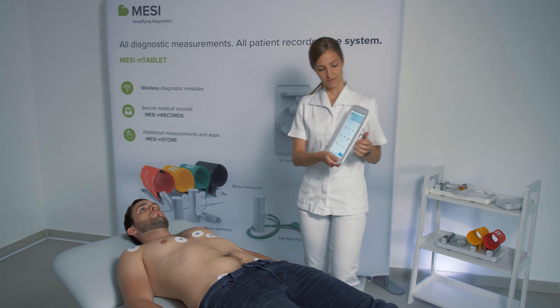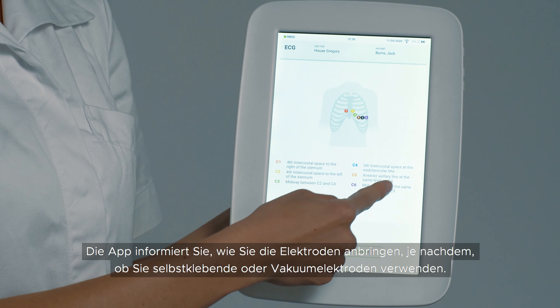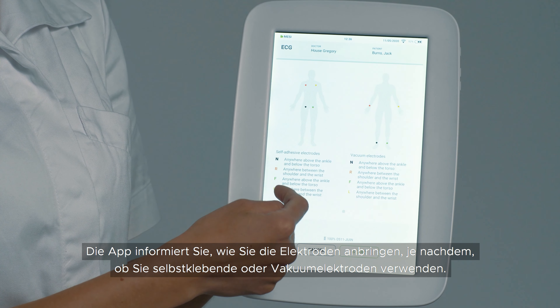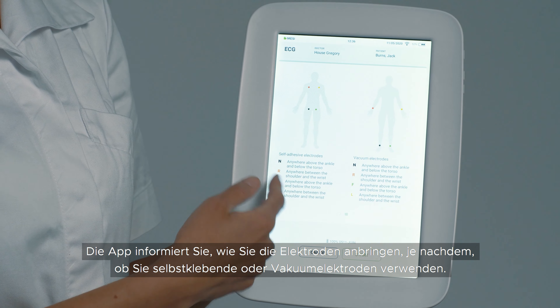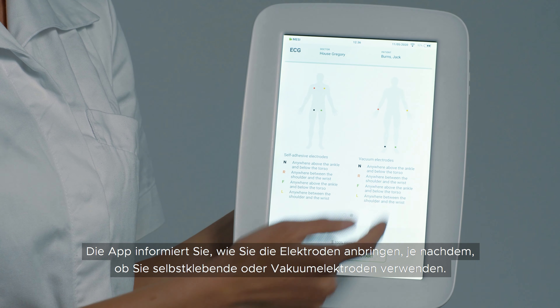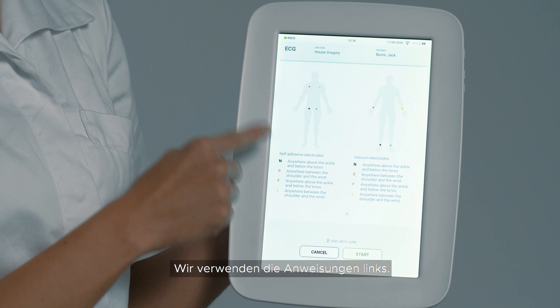After you have chosen your patient, you go into the ECG application. The application will let you know how to place the electrodes, whether you're using the stick-on electrodes or the vacuum electrodes.